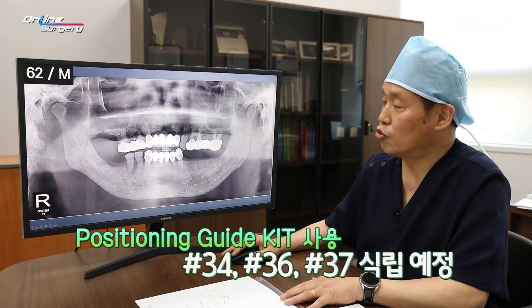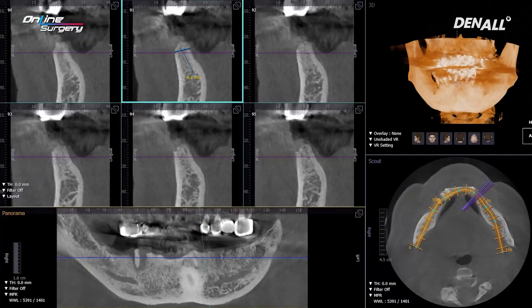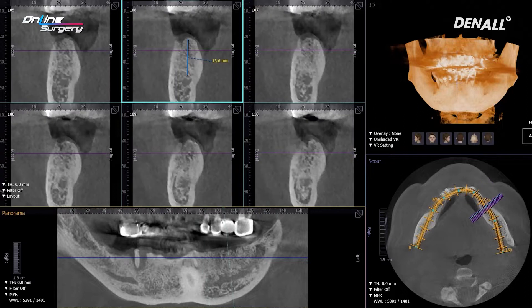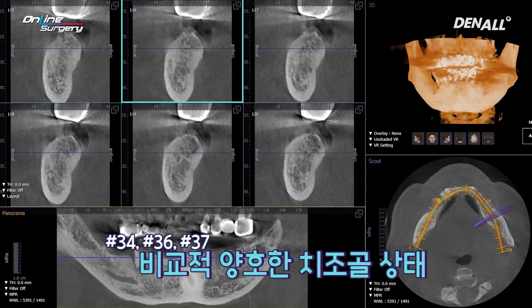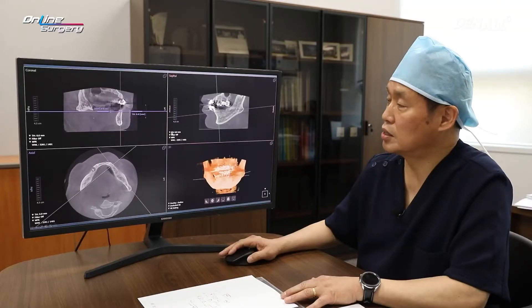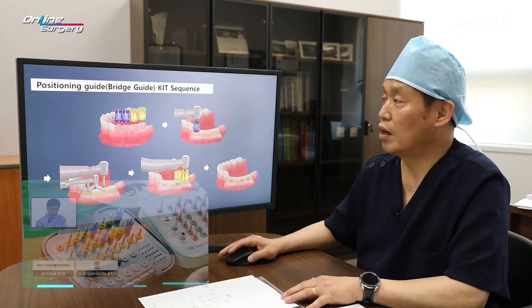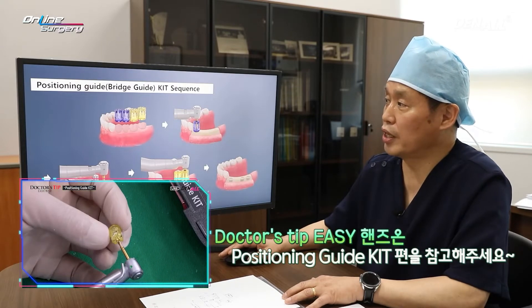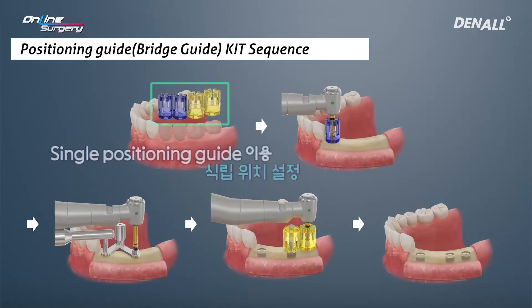A positioning guide was used for placing three implants: number four, number six, and number seven. Let's look at the CT — number four, number six, and number seven. Alveolar bone condition is comparatively favorable. On number four, implant placement is going to be done first. The positioning guide kit was shown at the Doctor's Tip Easy hands-on earlier. Two premolars and two molars — a single positioning guide — were used to get position.